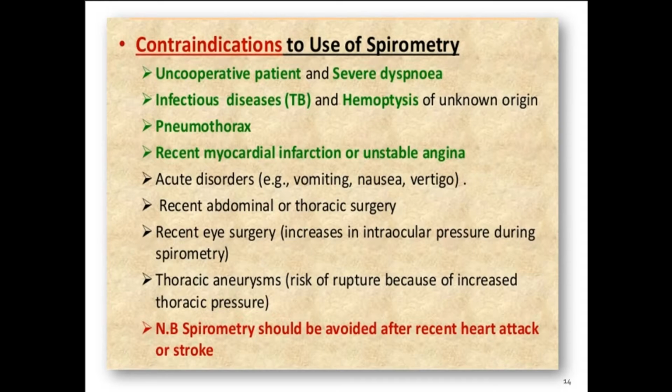Recent abdominal or thoracic surgery. Recent eye surgery, because of increases in intraocular pressure during spirometry. Thoracic aneurysms, risk of rupture because of increased thoracic pressure. Spirometry should be avoided after recent heart attack or stroke.